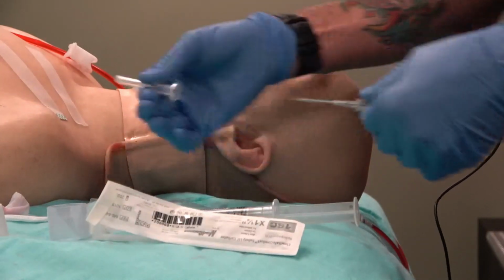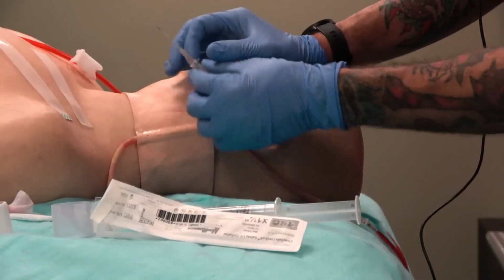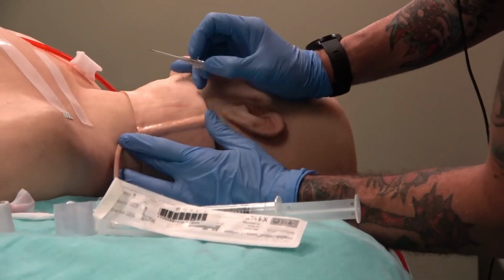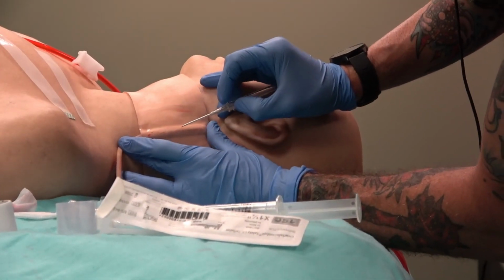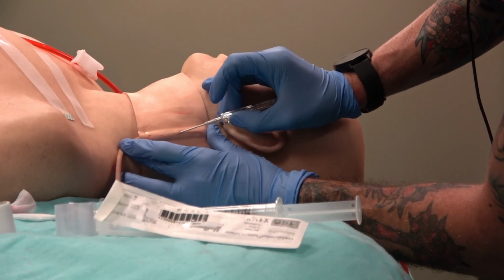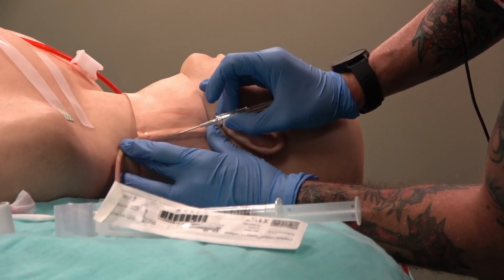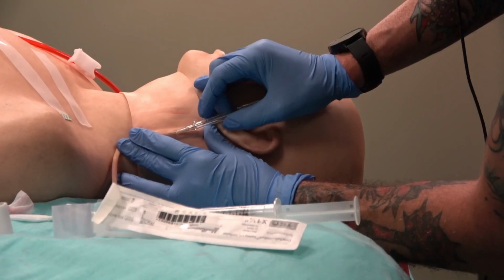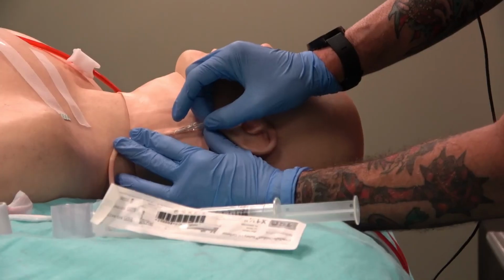Alrighty. So I got the patient's head turned to the side. I'm keeping the skin relatively taut. And I'm going in at a more shallow angle than I would a traditional IV. Okay. All right. Now, this is a large vein.